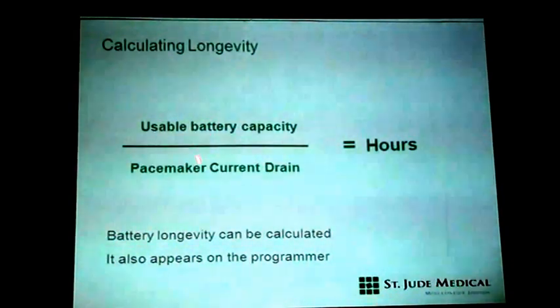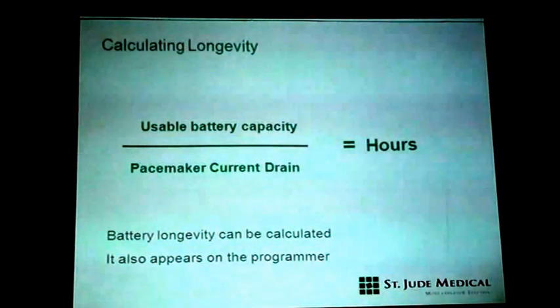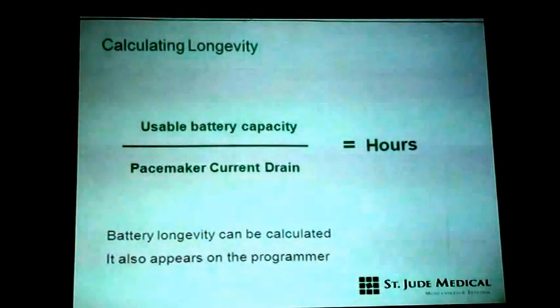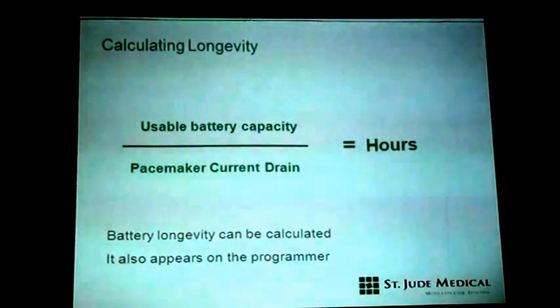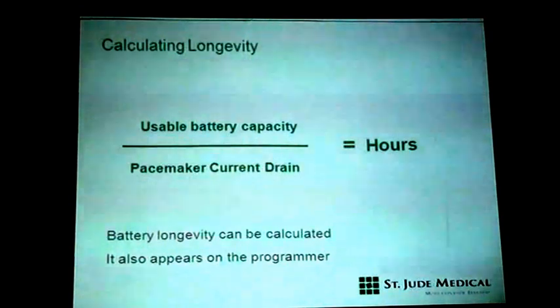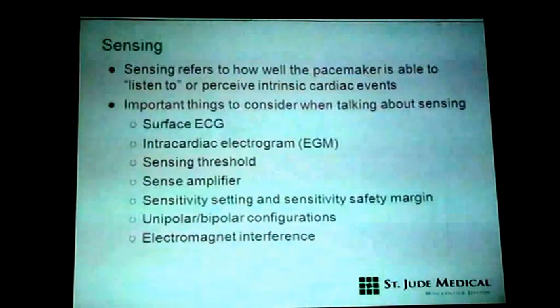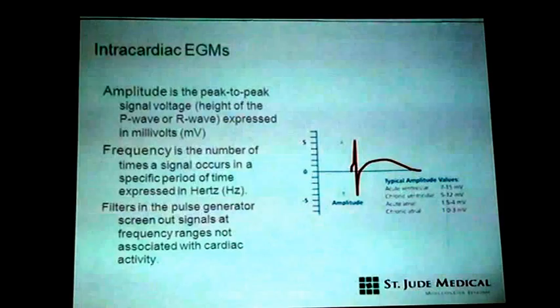So capacity and drain is the important part of calculating the longevity. Now the pulse generator is able to tell exactly, like 2 years and 3 months. If this is the criterion, then your battery will last another 3 to 4 years.